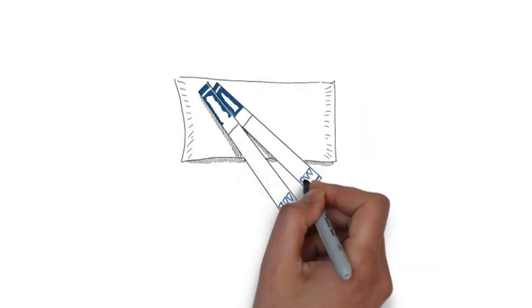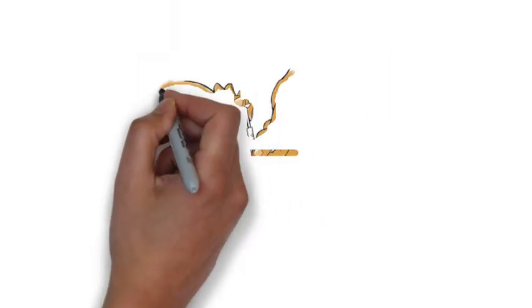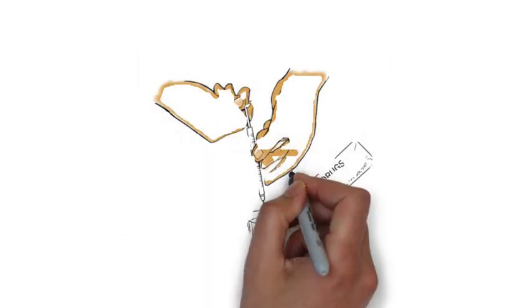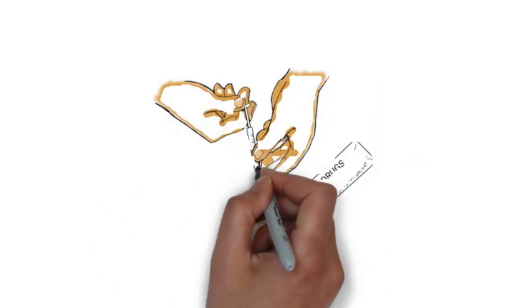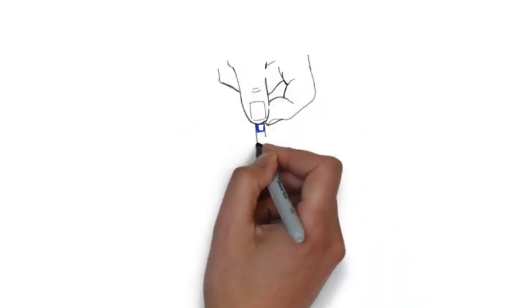Did you know that you can use urine test strips to see what's in your drugs? It's quite simple, and no, you don't have to pee on them. Let's say you had some drugs you were going to inject. Prepare your shot as usual, making sure to use a sterile, never-before-used cooker as well as a sterile syringe. Draw your shot up into the new syringe and set it aside. Now, add a little water back into the cooker.